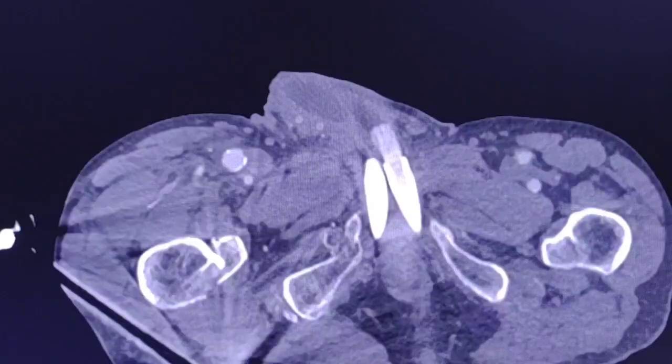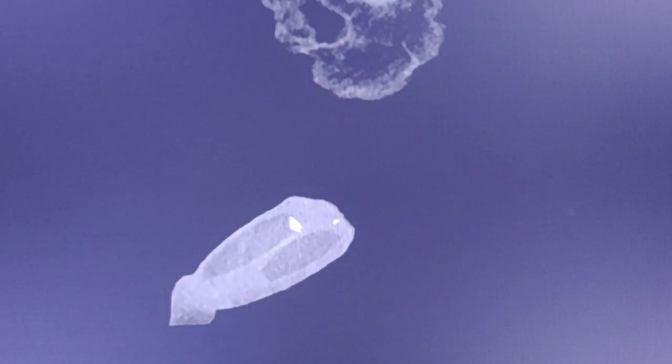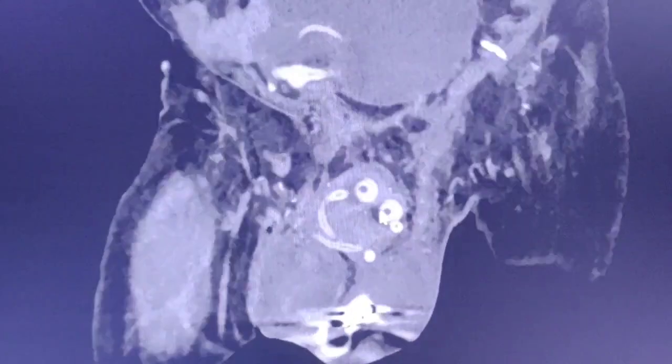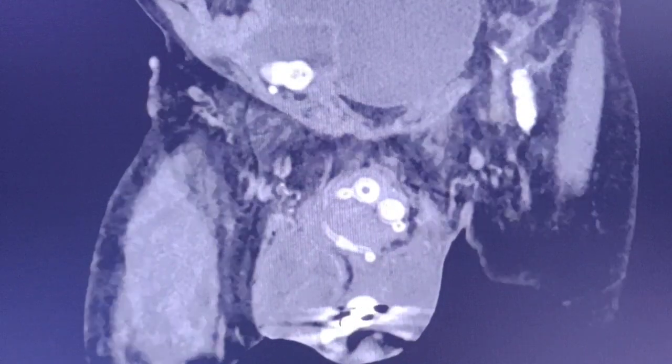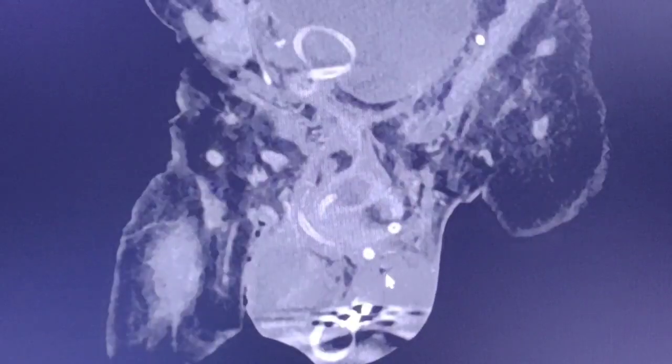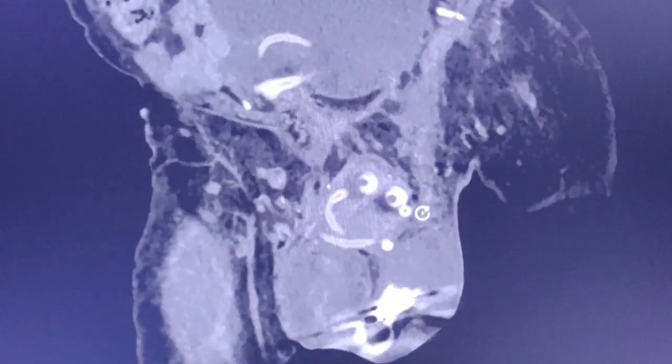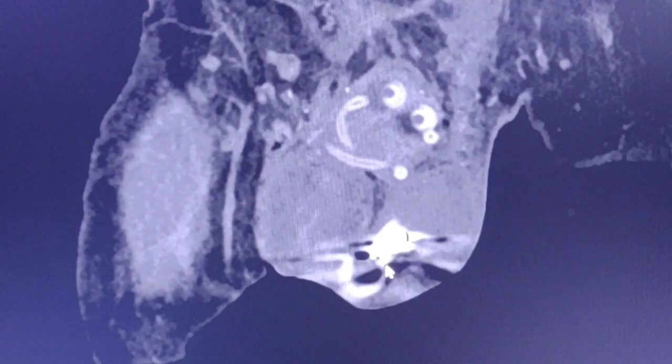Let's have a look in coronal views. Here is the penis and we can see the implants in the corpora cavernosa bilaterally. Let's go a little back and we can see the metal part, the base of the implants, and we can see also the pump in the scrotum here.